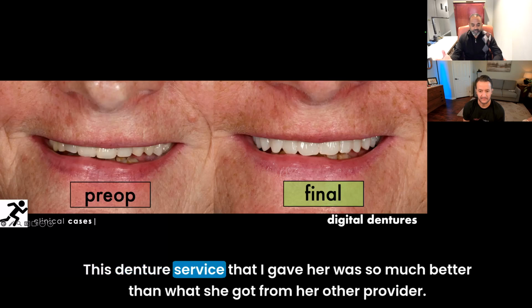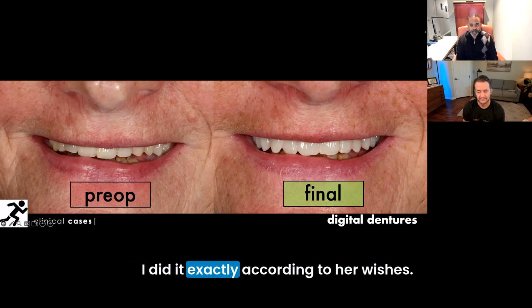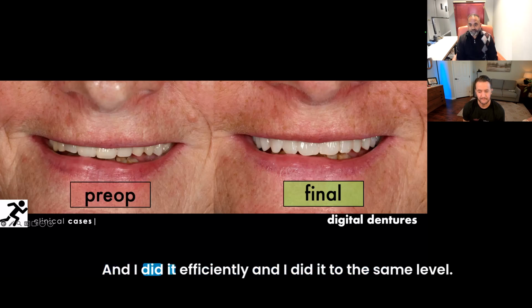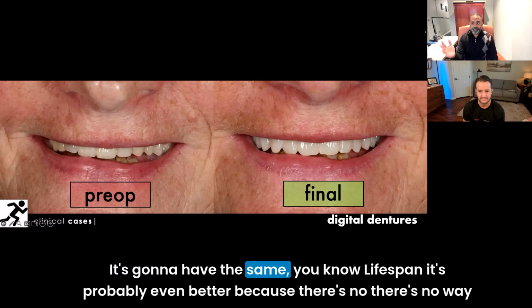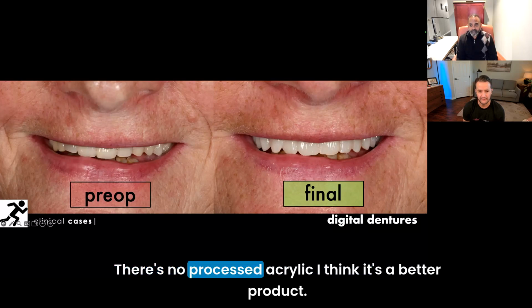This denture service that I gave her was so much better than what she got from her other provider. I think it is worth more because I did it in less time. I did it exactly according to her wishes, and I did it efficiently. And I did it to the same level. It's the same strength. It's going to have the same lifespan. It's probably even better because there's no way that a denture tooth can pop off this. It's a monolithic denture. It's very strong. There's no processed acrylic. I think it's a better product.